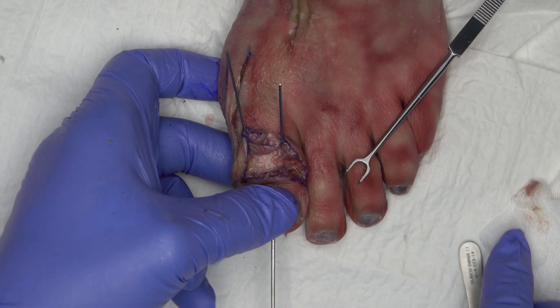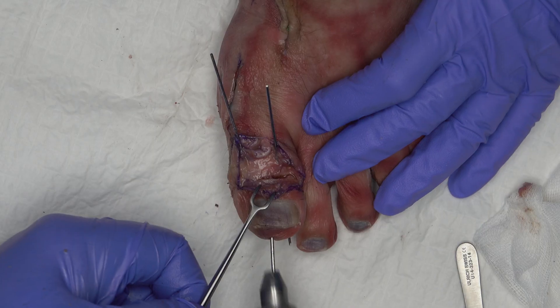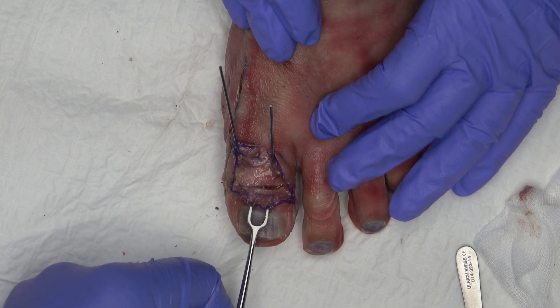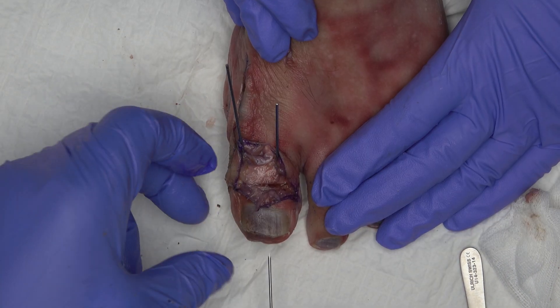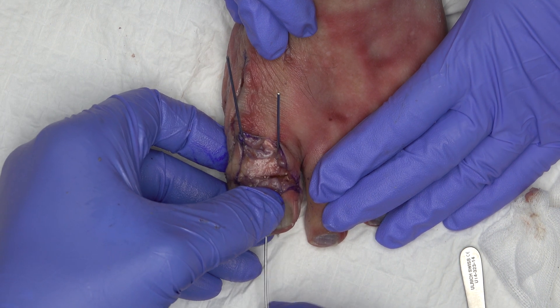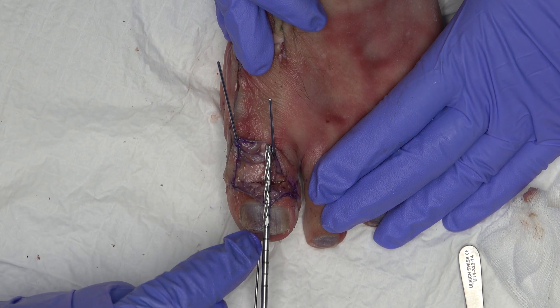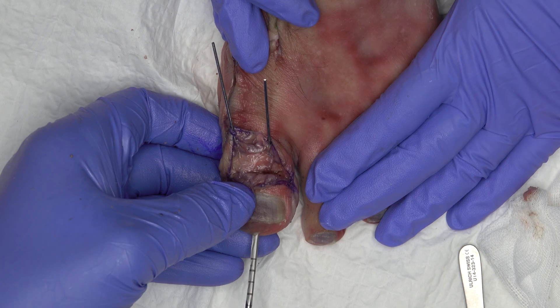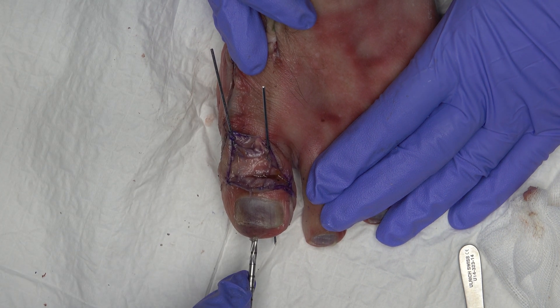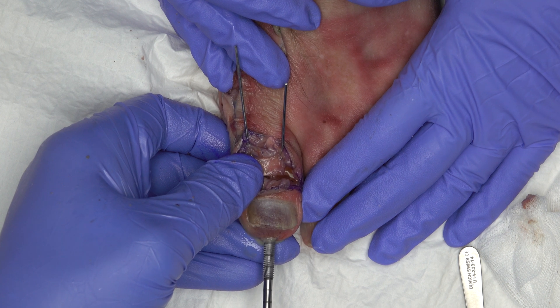Once the IP joint is stabilized, a skin incision is made at the tip of the toe with the scalpel. The 1.6 mm K wire is exchanged for a 1.2 mm guide wire. Drilling and tapping is then performed over this 1.2 mm guide wire for Shark Screw. The reaming should be done gradually. For the IP arthrodesis, a Shark Screw Diver with a diameter of 5.0 mm and a length of 35 mm or 45 mm is required.